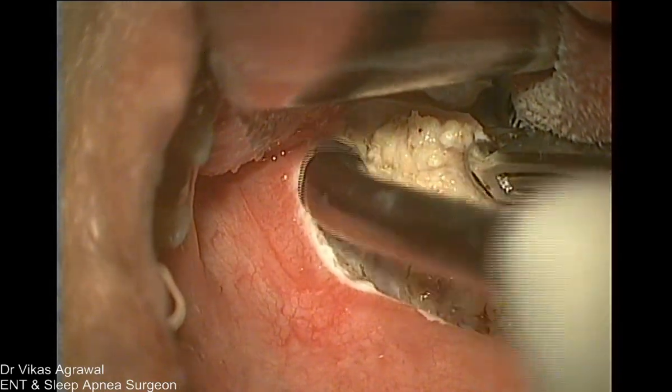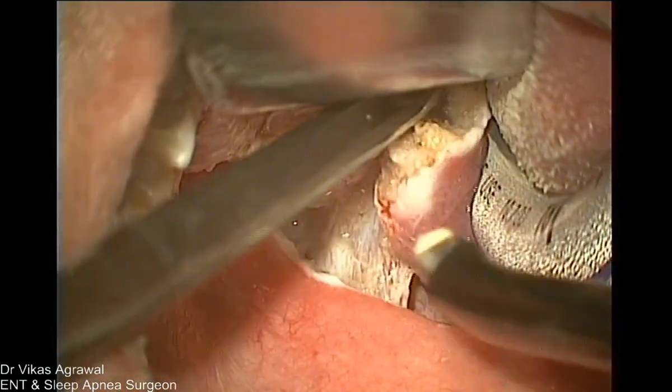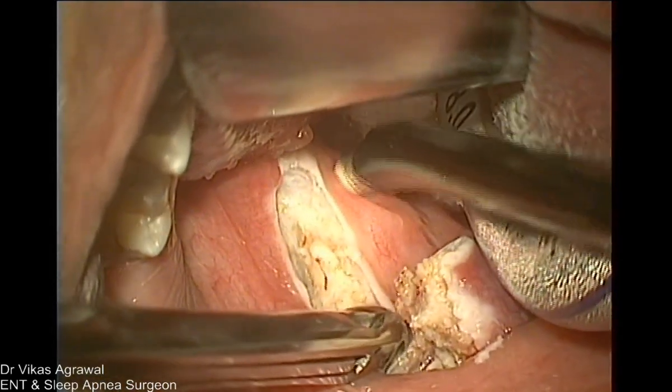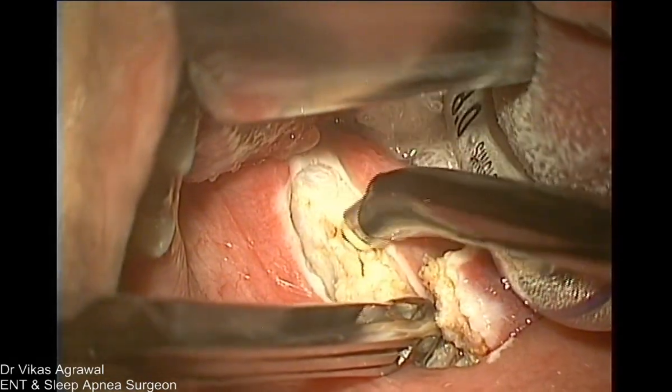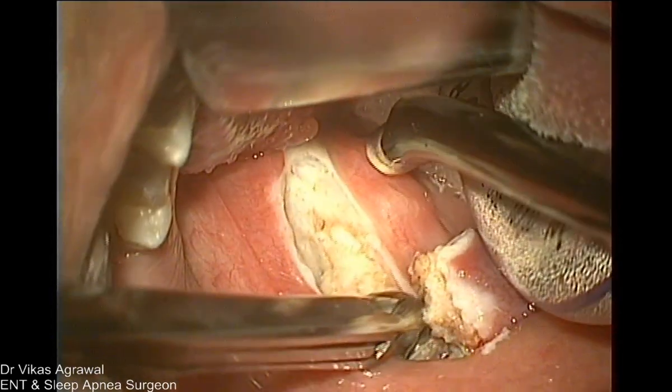But as we reach the lower pole, see, this is the lateral dissection of the tonsil. As we reach the lower pole, this is the lower pole. Can you see that? Yeah. So where does the tonsillar artery come? At the lower pole. The tonsillar artery comes at the lower pole.